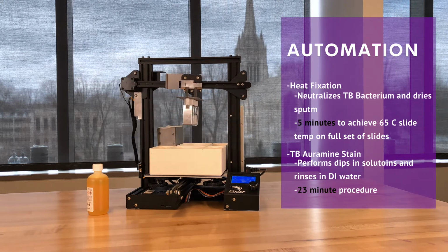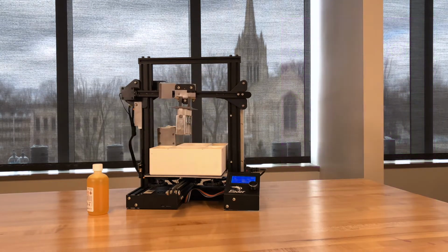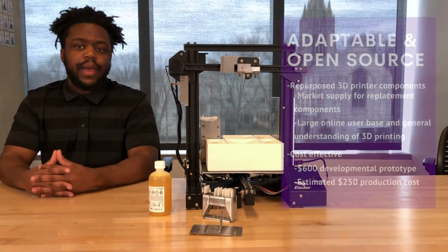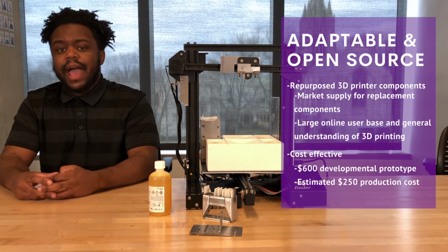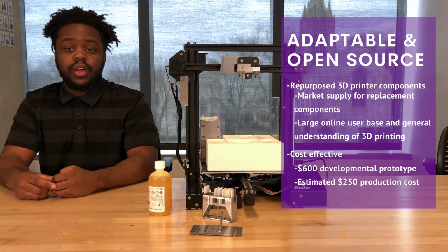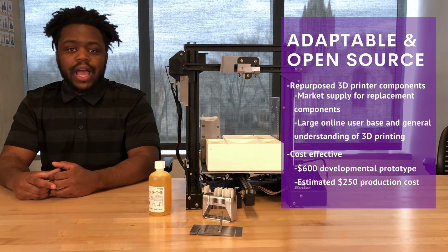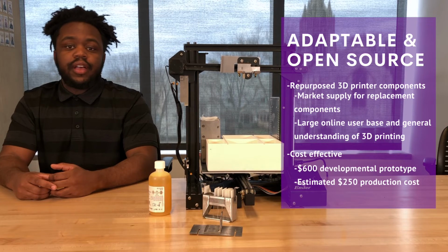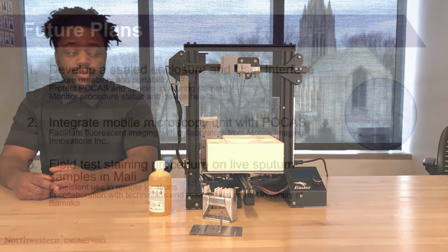Our firmware modifications and mechanical adjustments enable it to reproduce the acid-fast procedure. This gives POCAS a manufacturing and infrastructure advantage that more proprietary systems lack, as the components are readily available through the 3D printer market. As a result, this lightweight, reliable, and high-throughput diagnostic instrument costs under $600 to develop and will cost less than $250 to reproduce.